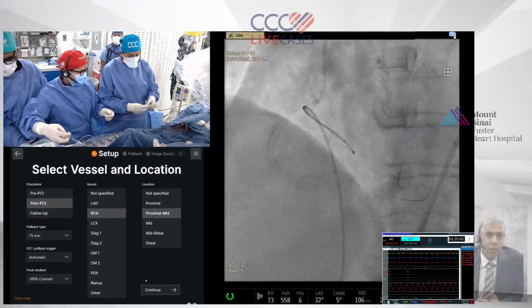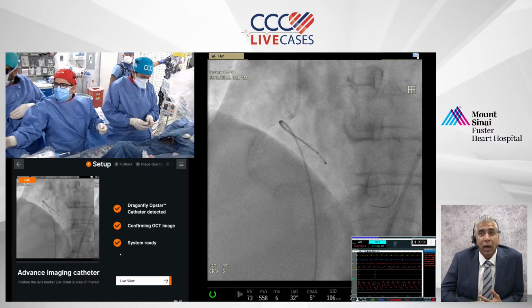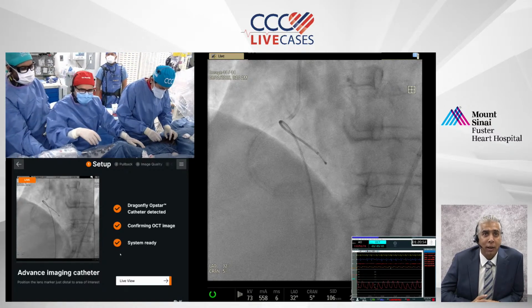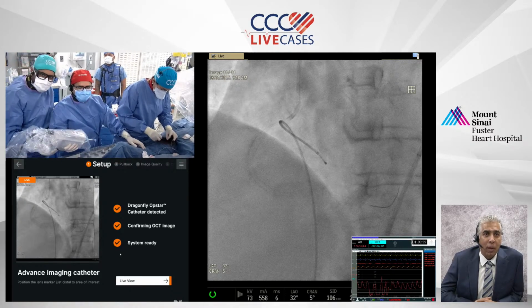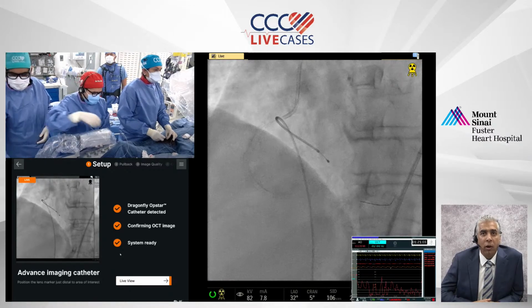Another value of the imaging is that prior to using imaging regularly, we would make a fluoroscopic judgment as to how to act in that situation, and a lot of times we'd have anxiety that evening. Now separating the dissections into groups is more helpful.